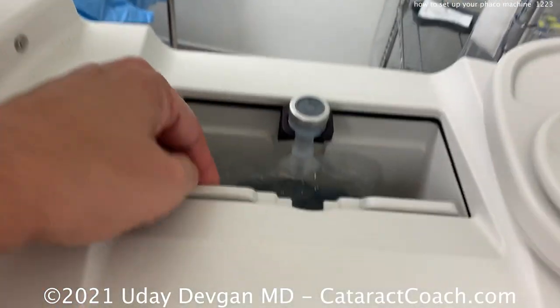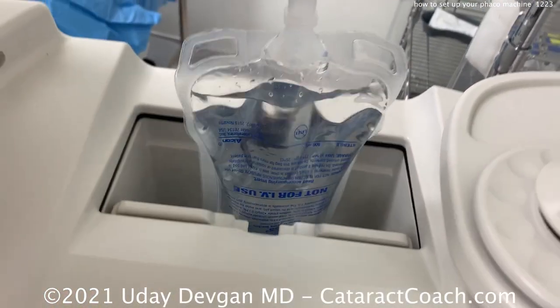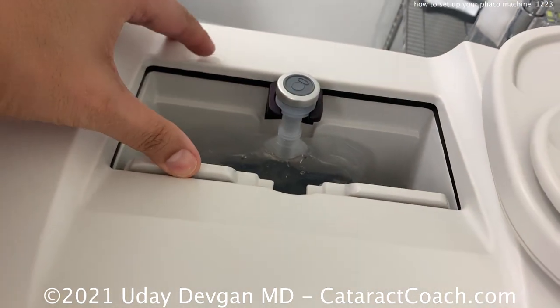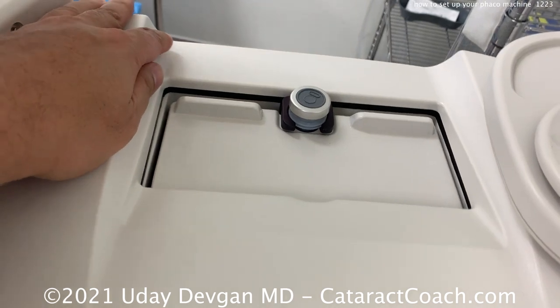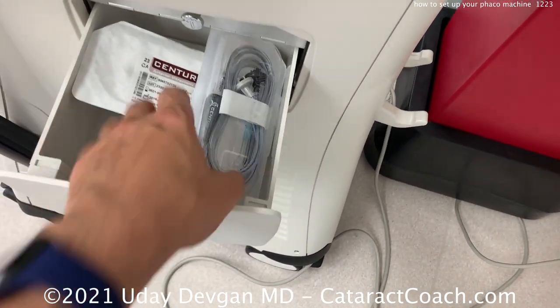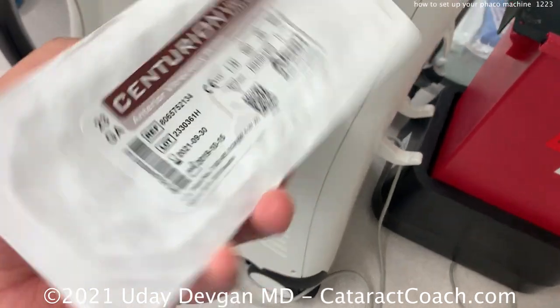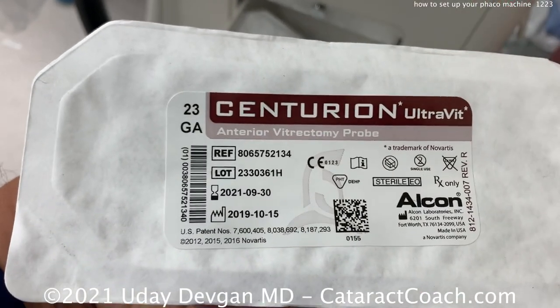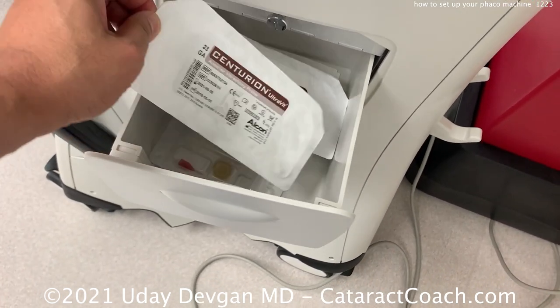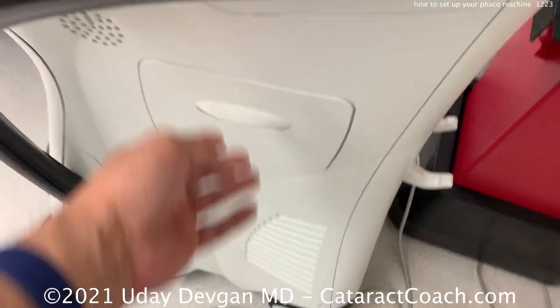Let's take a look here. We've placed in the bag of balanced salt solution — this is going to be specific to our machine, but you should know how your machine works. You close that and there are some pressure plates in there that'll squeeze the bag. Now here on the side there's a little special pocket. We save a little packet of anterior vitrectomy just in case we need it — it's right there, ready to go. You don't have to hunt for it; it's always going to be there in the machine.